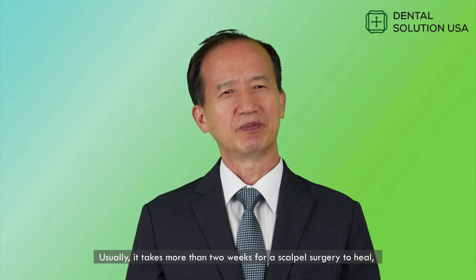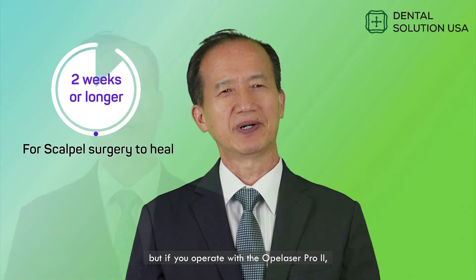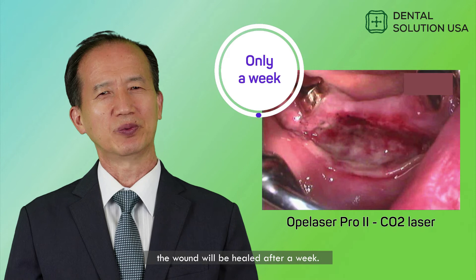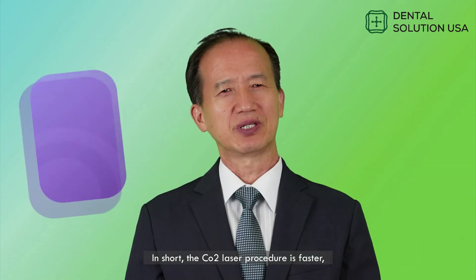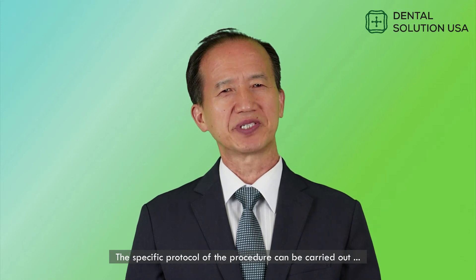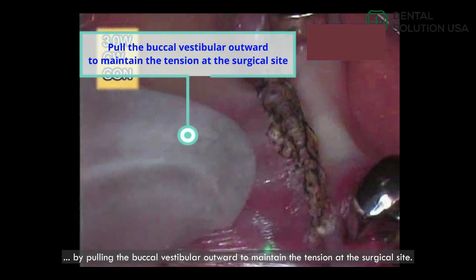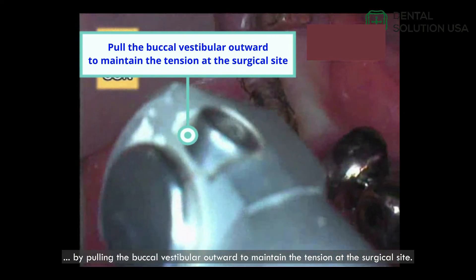Usually, it takes more than two weeks for a scalpel surgery to heal, but if you operate with the Opulaser Pro 2, the wound will be healed after a week. In short, the CO2 laser procedure is faster, prevents swelling, and avoids bleeding. The specific protocol of the procedure can be carried out by pulling the buccal vestibule outward to maintain the tension at the surgical site.